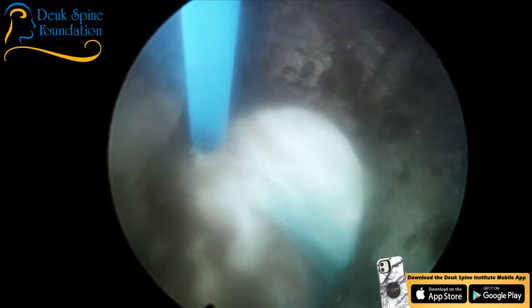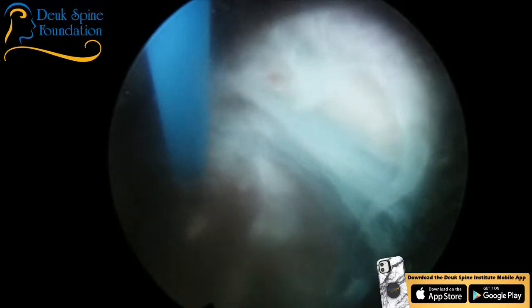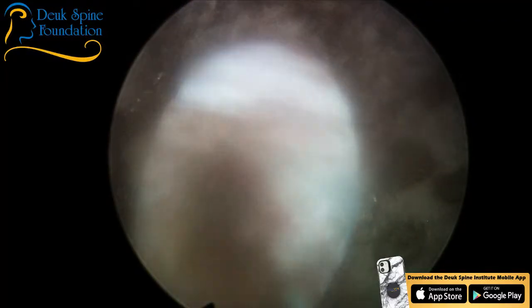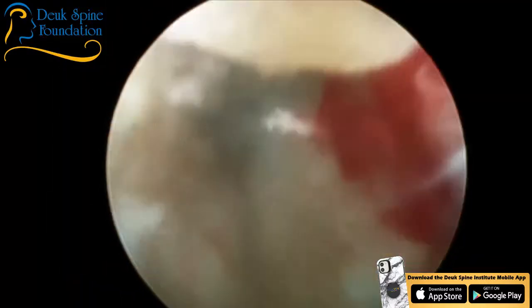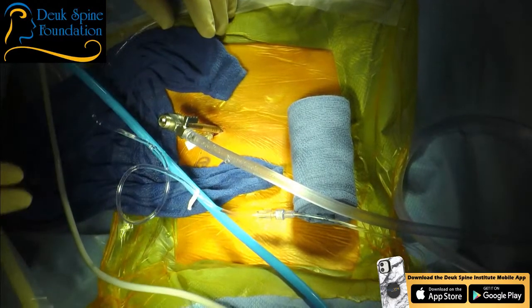Okay, the nerve root should be right there. There it is. You see the white thing? That's the nerve root. So that's in the foramen. The disc herniation's gone completely. Laser off. So we'll suck the water out. There it is. A nice dry foramen. Scope off. So no medicine, right?